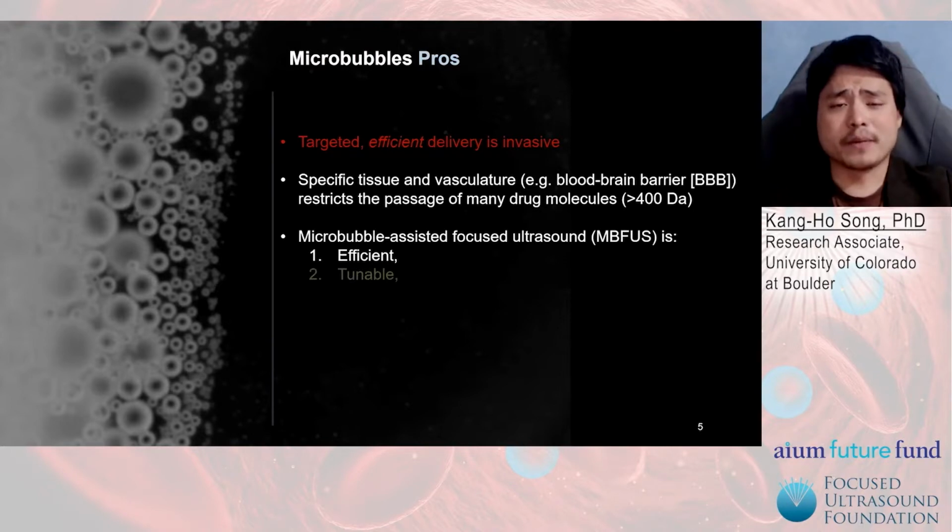Number two is that the microbubbles add a new set of parameters that may be adjusted to either enhance a desirable bioeffect, such as kidney stone breakage in lithotripsy, or to reduce unwanted bioeffects, such as cell and tissue damage in something such as blood-brain barrier disruption. We'll speak more on that later.